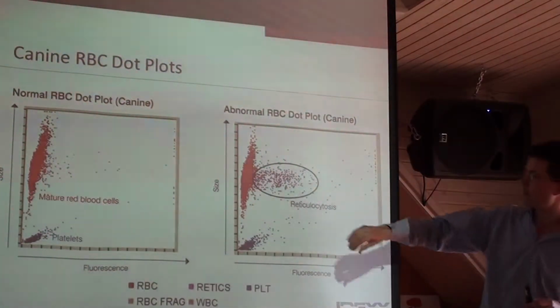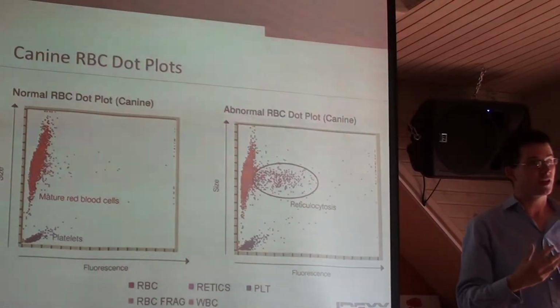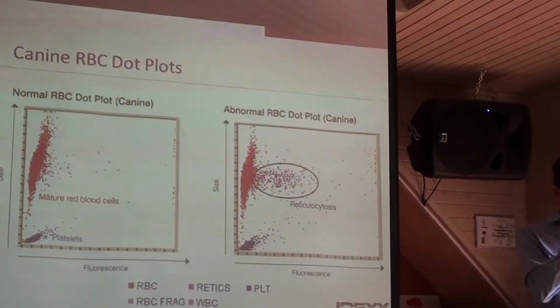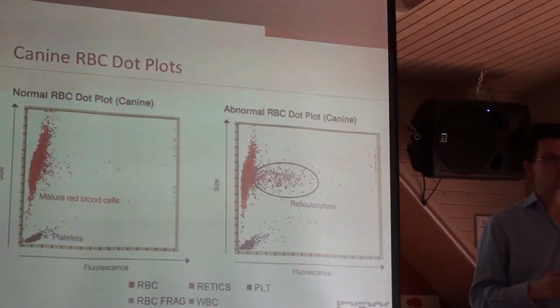Now I have simplified there, and it's not that you would find an absence of reticulocytes here, but what I want to convey is how much information is found within these graphical reports.